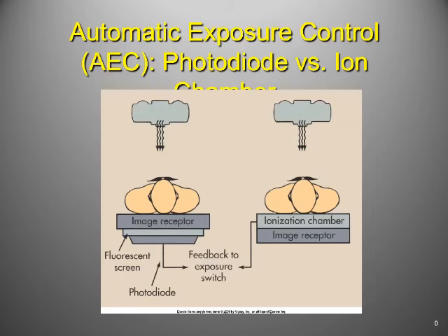But the ion chambers that you energize will be making measurements of X-ray exposure within an ion chamber. Well, what's an ion chamber? I will refer you back to last week in our discussion of the pocket dosimeter. An ion chamber is, as ionization occurs within this chamber, positive potential or negative potential is stored in the walls of the chamber, and it can make a reading. It can read so many exposures have occurred within this chamber, right? So it's a way of measuring the amounts of radiation in something.